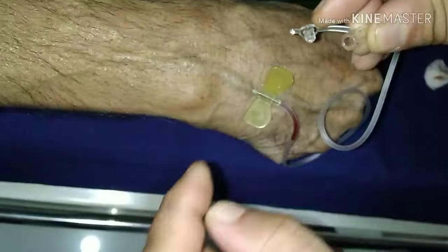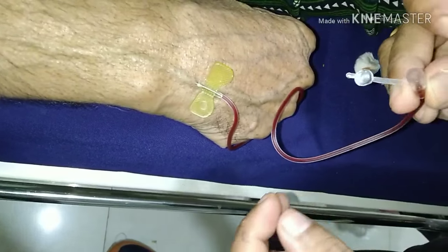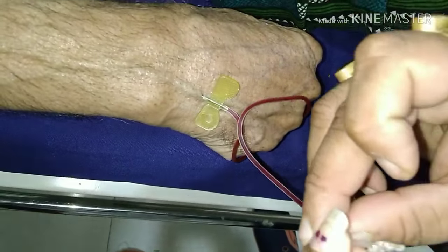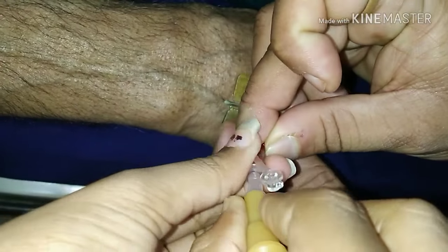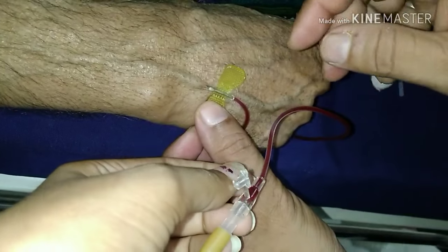Check for blood flow to confirm correct placement.